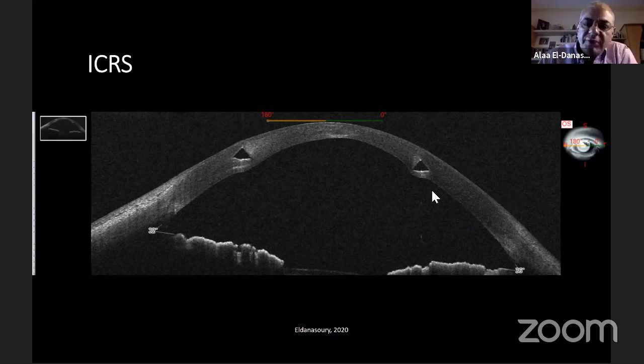In this case, for example, you can tell that the surgeon here, which is myself, did not do a good job here because the ring is kind of superficial as compared to the other rings. So in order to achieve good results, you need to have symmetrical placement, like in this case, for example. Now, but what I want to draw your attention at is something different today.